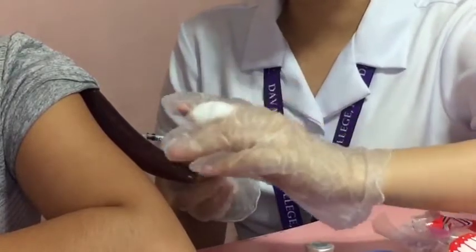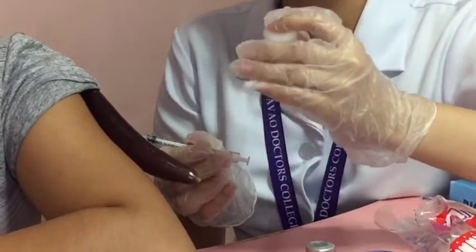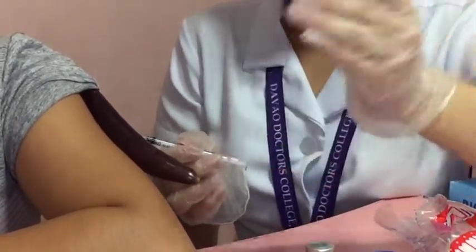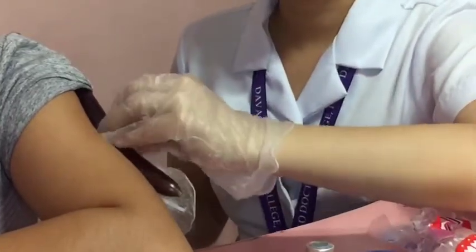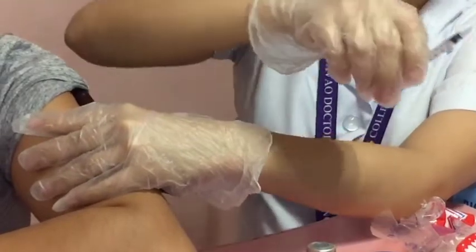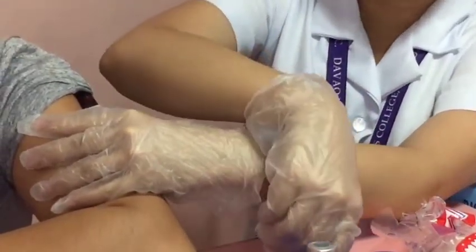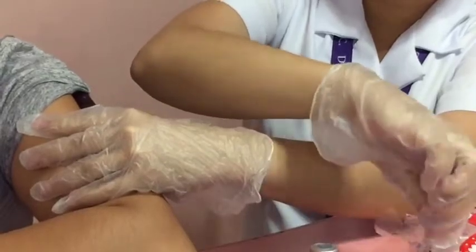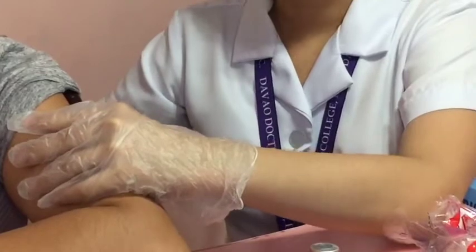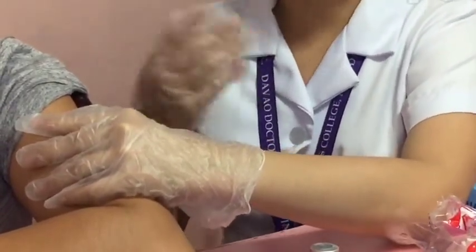Now let's remove the needle smoothly by pulling along the line of insertion while depressing the skin with our non-dominant hand. Depressing the skin minimizes the client's discomfort after withdrawing the needle. If bleeding occurs, apply pressure to the site with dry sterile gauze until it stops.